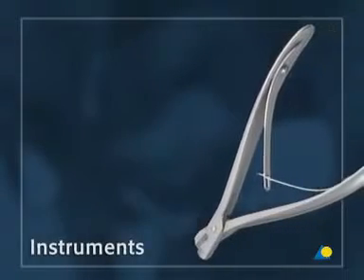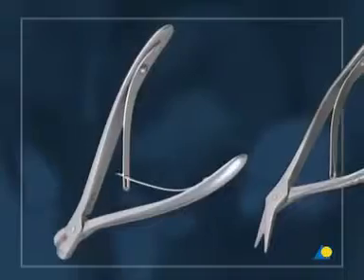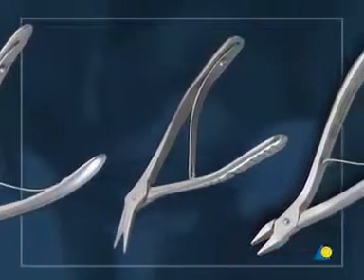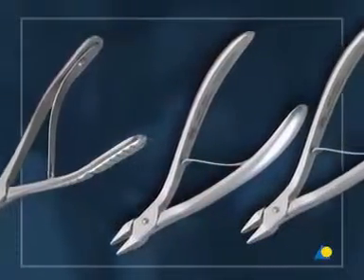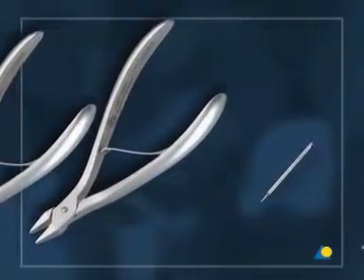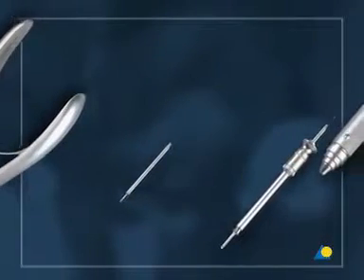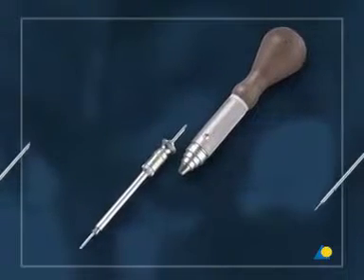The instruments needed are the plate cutters, the cutter for mesh plates, and two bending pliers. For 1.3 mm screws: the 1 mm drill bit with 6 mm stop and the 1.3 screwdriver shaft with holding sleeve and handle.